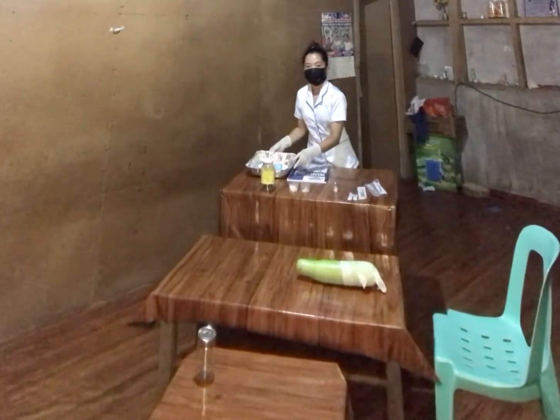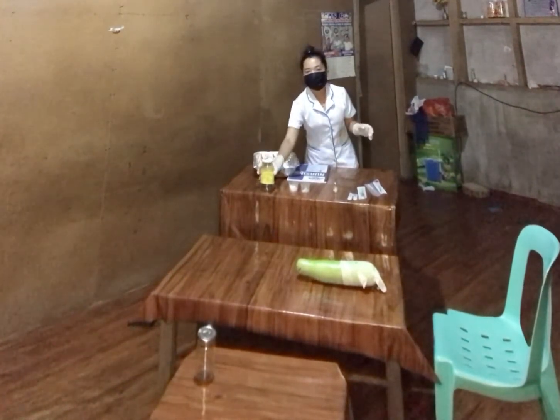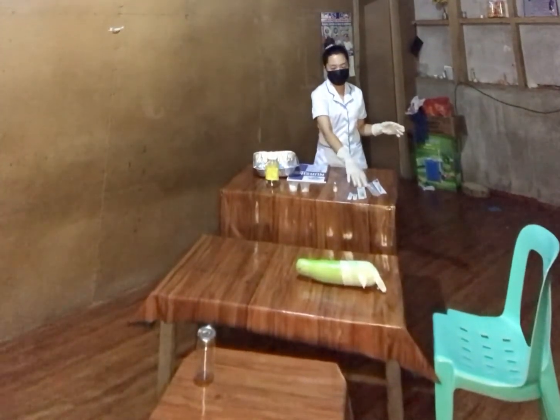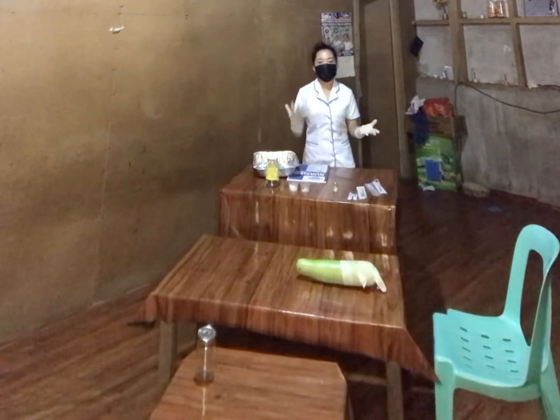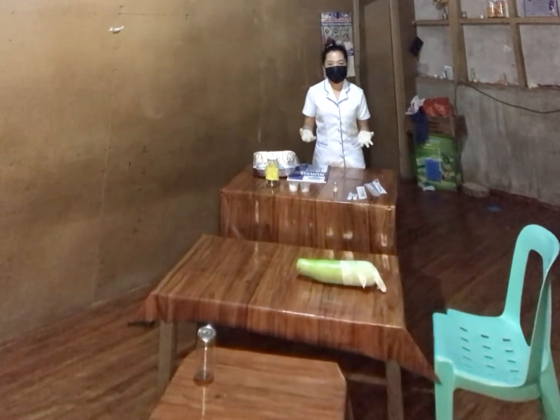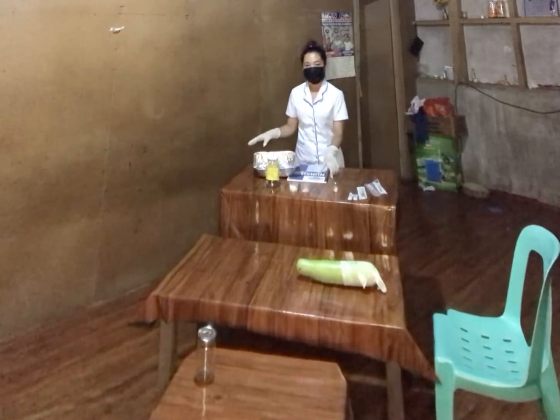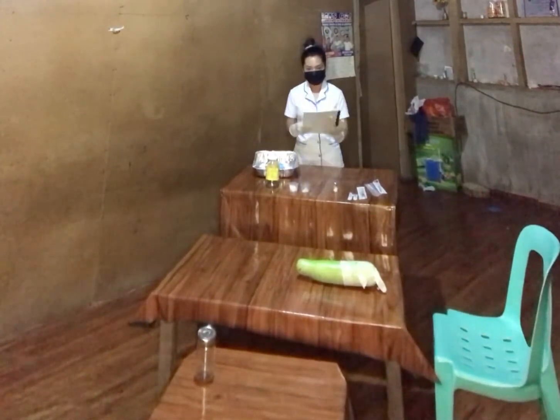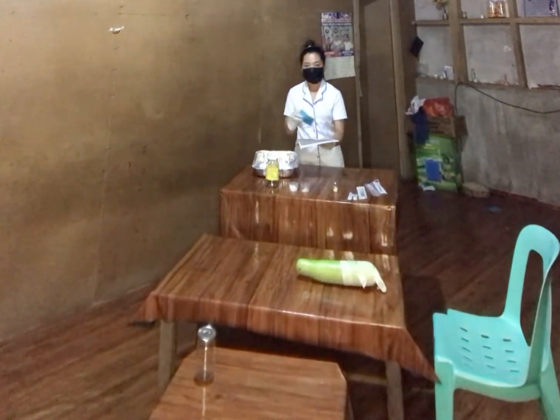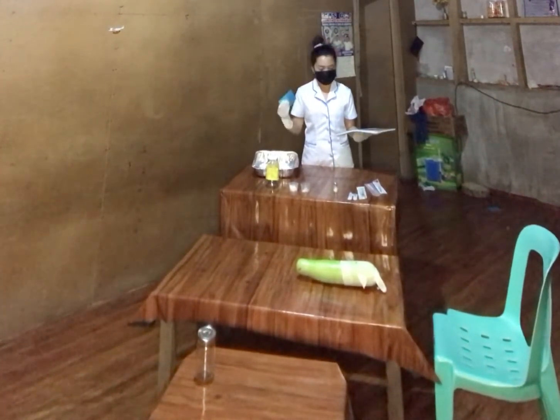This is the hypodermic tray, and lastly I have a waste receptacle where I am going to dispose of the used needle. This is the needle. So all of the equipment is now prepared. Now check the doctor's order against the medication administration record. This is done to identify what kind of drug is to be given.